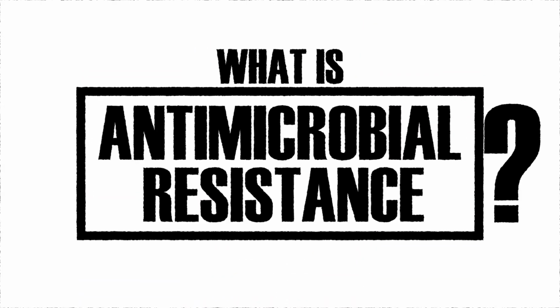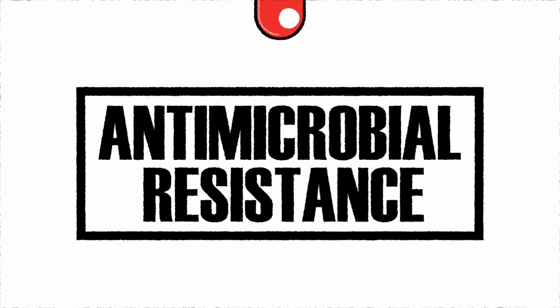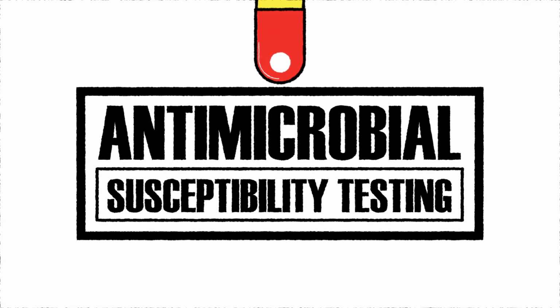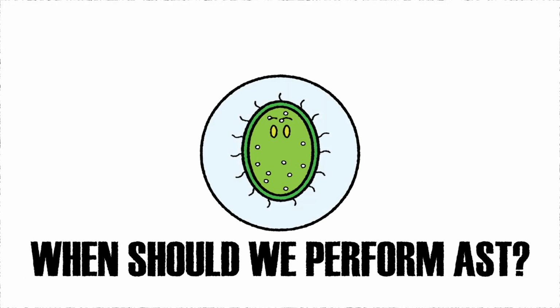What is antimicrobial resistance? Antimicrobial resistance is the ability a bacterium gains that allows it to evade the effects of an antimicrobial. Antimicrobial susceptibility testing, or AST, helps us to find out whether a bacterium has developed resistance to an antibiotic. When should we perform AST?